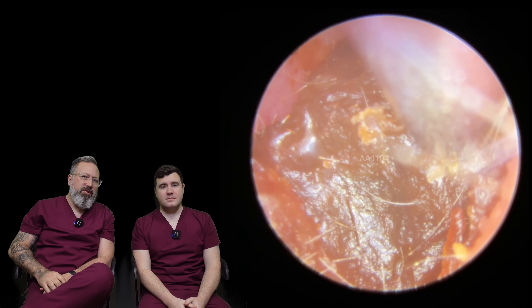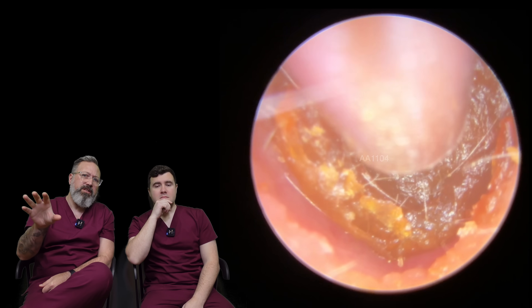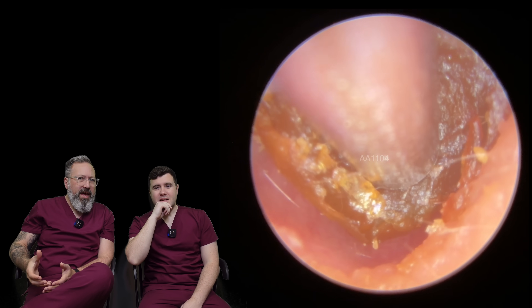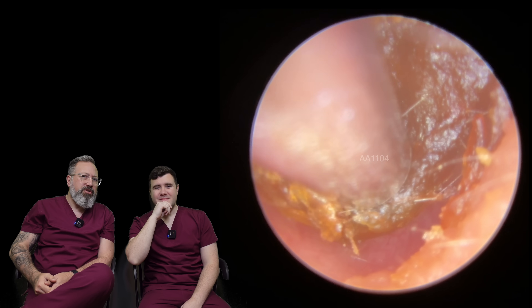Which I can't spot at first, because you can see I'm looking, probing around the front of this plug just to try and find anywhere I can get a little bit of purchase, a little bit of good suction grip. And I thought, oh great, it's moving, it's going to come away. But it just didn't budge.